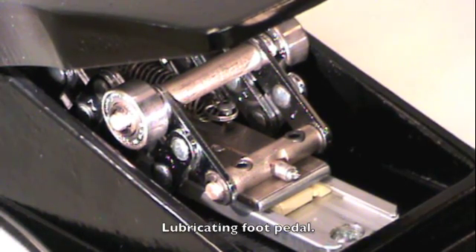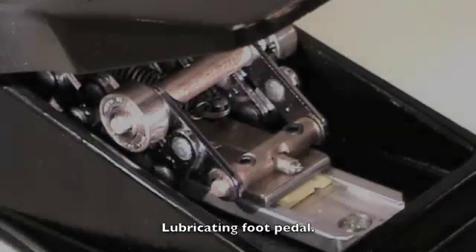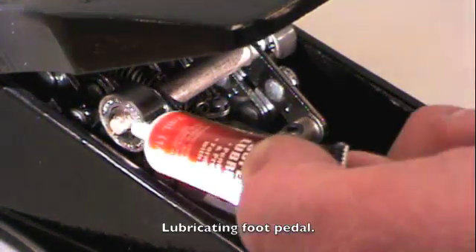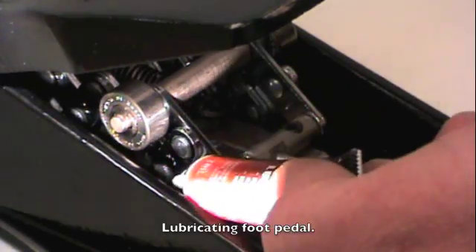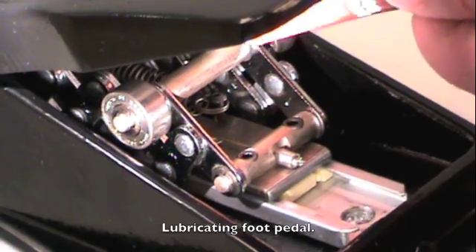Only lubricate the foot pedal's mechanical moving parts as needed, using tri-flow lubricant. Use of other lubricants may damage the internal parts and void the warranty. Additionally, only use the tri-flow in a tube. Using your tri-flow, you want to hit all the pivot points and the bearings on both sides of the foot pedal, applying a slight little dab of oil on all the pivot points, going all the way back into the foot pedal.